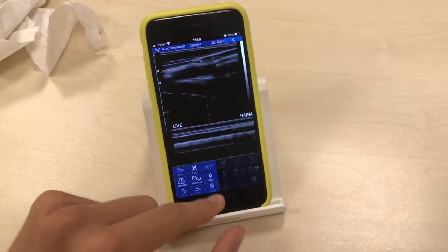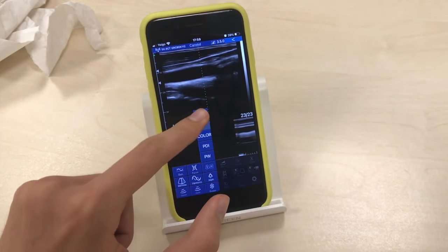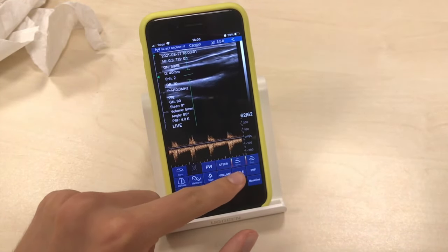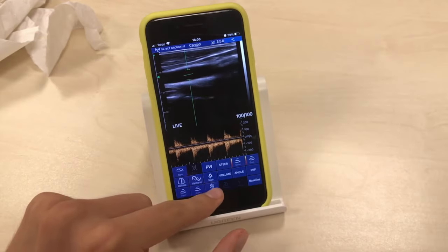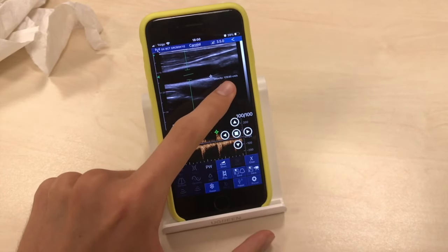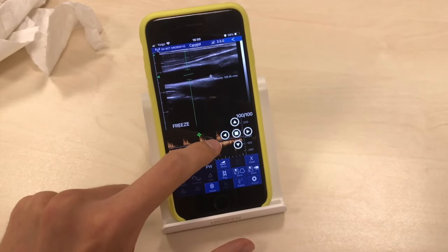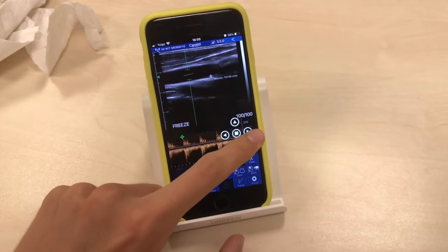Here you're seeing the M-mode. You can freeze the image and measure. Now the Pulse Wave Doppler — you can correct the angle, and here you're seeing the Doppler curve. You can freeze and measure; for example, to measure velocity, you click and get a reading of 128 cm per second. You can click with your finger or move the cursor with the arrows, which is useful if you have a wide finger.